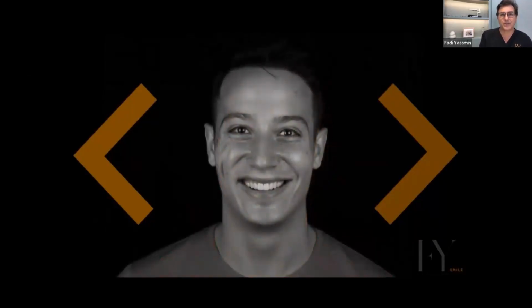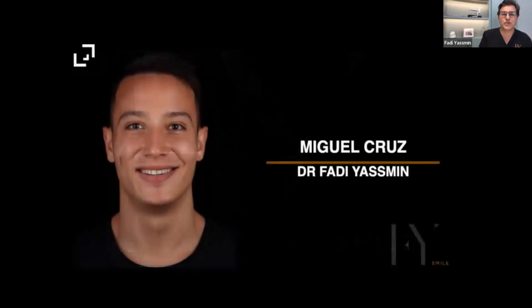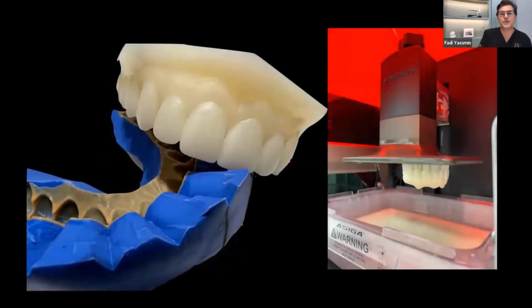And even myself as a dentist, because each case is quite unique and quite special. These patients are coming in with the hope of achieving a particular result. In fact, some of these patients don't know these results can be achieved. So how do we do that? Well, ideally, once we've digitized the patient, as you can see, we use the intraoral scanning, we generate a model. And we've been using digital dentistry for a good 7 to 8 years now.